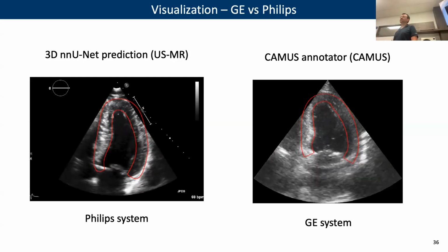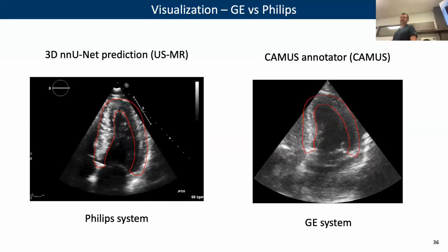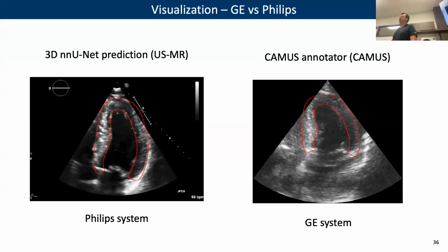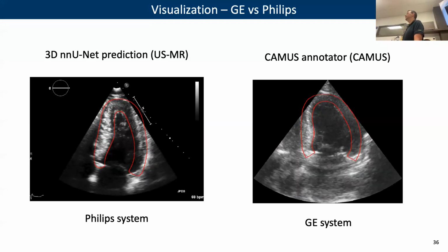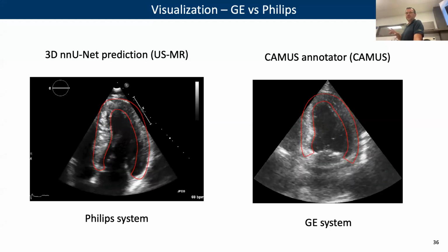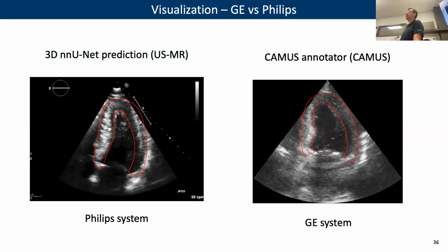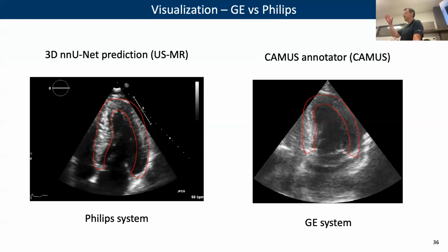Yeah, there are a lot of studies trying to improve the image quality. One of the keys is the correction of aberration. This is something I really believe in, and also the estimation of the sound velocity. It's maybe a little technical, but for the reconstruction of the image, all the methods assume that the sound speed is the same, homogeneous in all the image, which is not the case. That creates distortion and artifacts.